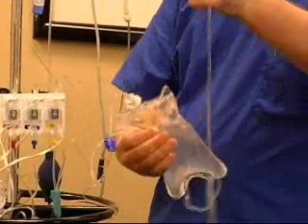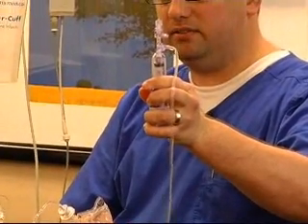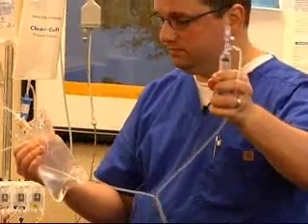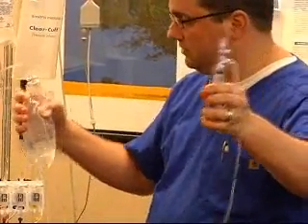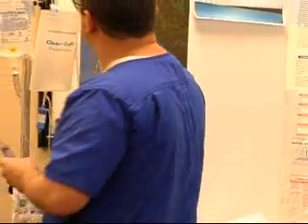So you're going to pull back, and you can see your syringe works just like a regular syringe. You can see you've got air trapped in there, and there you go. So you've got all the air out of the system. This does not have to be on a pressure bag, by the way.